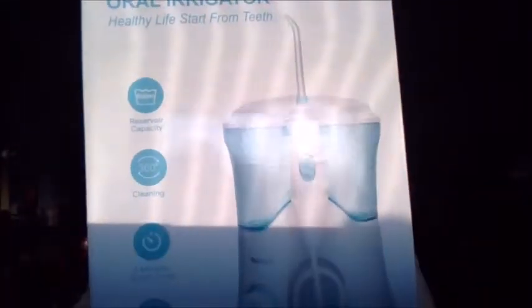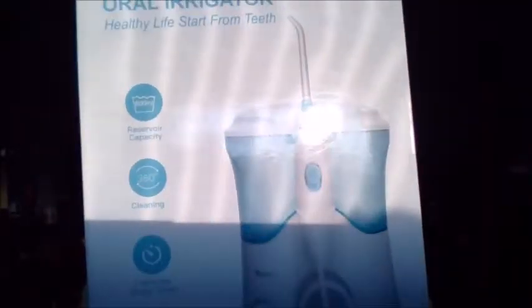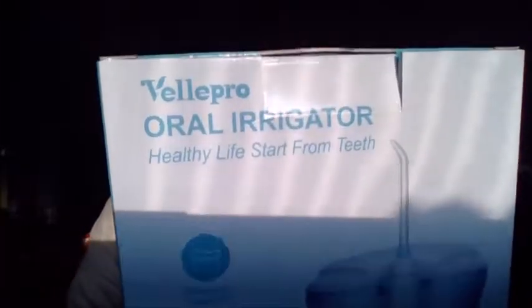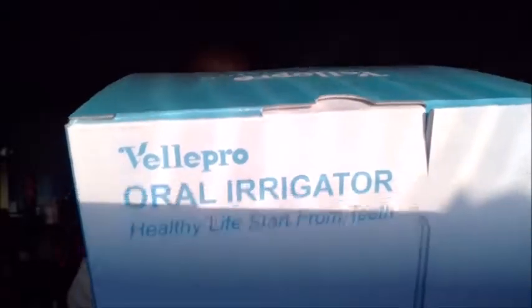I'm actually giving this to my other daughter so that everybody has one. This is what it does: reservoir capacity, three-minute smart timer, and pressure setter. It has three classic jets — a periodontal tip, a dental flat tip, an orthodontal tip, and a tongue cleaner. It says five kinds of unique tips, exquisite appearance, best water capacity, no refills, three-minute smart timer, and ten pressure ratings.